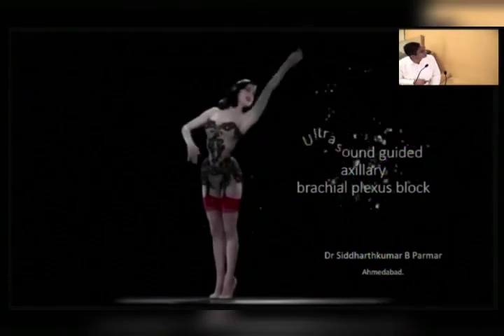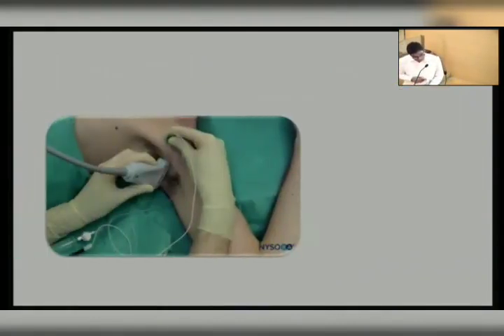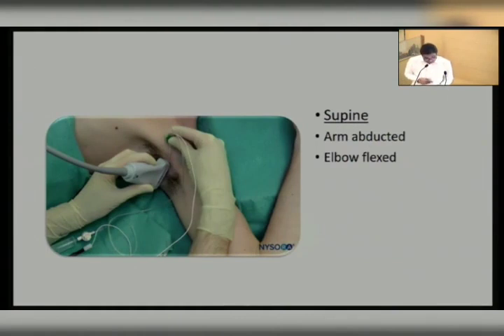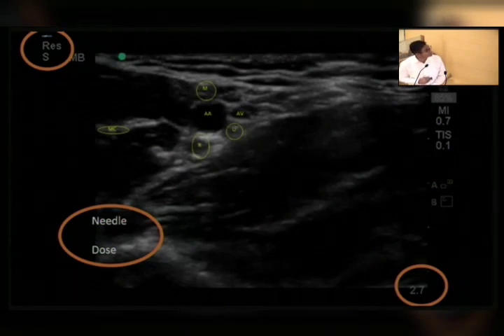So the next block is the axillary block. In that, as we all know, it is an individual nerve level block and 4 nerves are targeted. The same arm abducted, elbow flexed, and the probe is placed transversely in the axilla, and the machine setting is almost the same. When we put the probe on the axilla, we first find the anechoic pulsatile axillary artery, and most of the time the nerves are near the axillary artery.